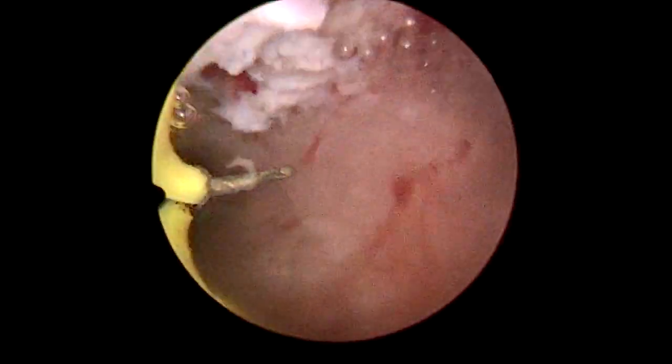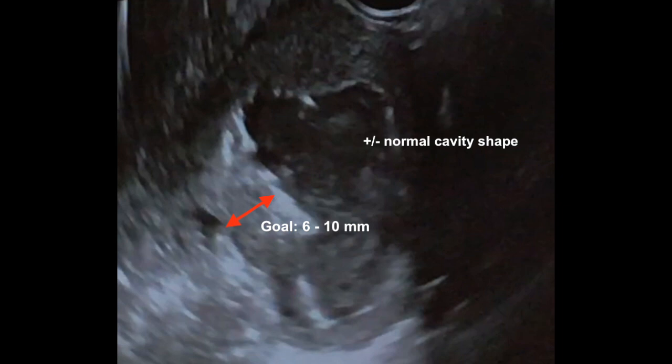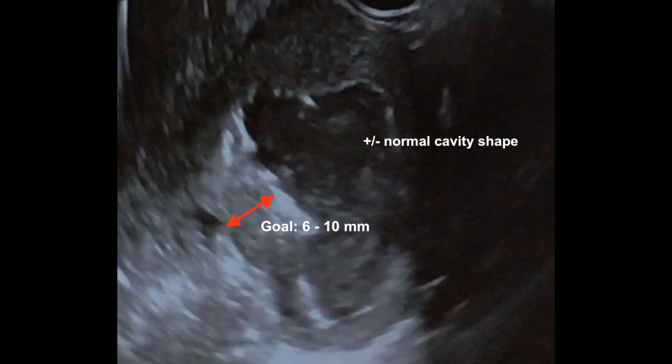In the final step, transrectal ultrasound is used once again to check the fundal myometrial thickness and prevent excessive incision of the fundal myometrium. The goal is to achieve a fundal uterine wall thickness between 0.6 and 1 cm, with a semi-normal uterine cavity at the end of the resection.